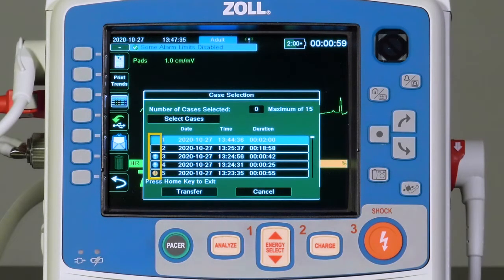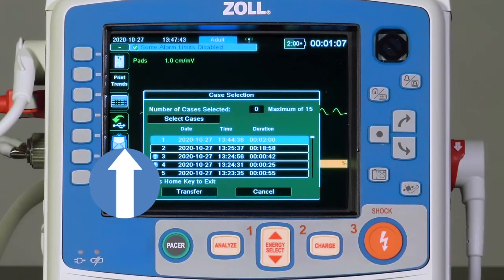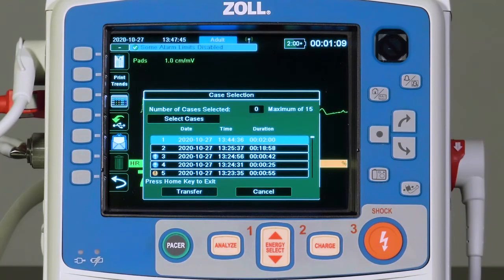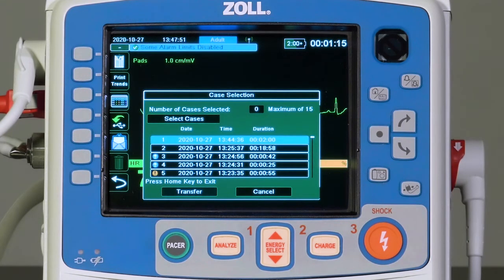The screen displays a color code to the left of each case listed. A blue circle with an upward arrow indicates that the case has already been successfully transmitted to Zoll Online. A yellow circle with an exclamation point indicates an unsuccessful attempt to transfer the case. No symbol means that no attempt was made to transfer the case to the cloud.